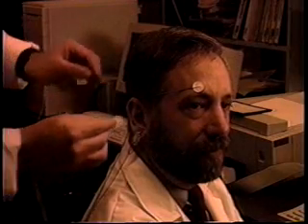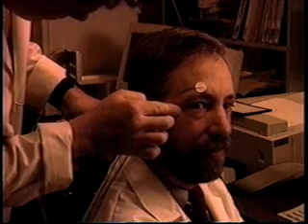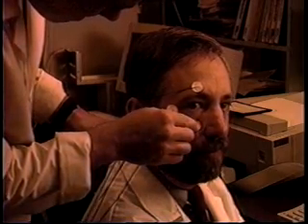We have developed a system that allows the user to control the computer directly through electrodes. Electrodes are placed above and below an eye and to the left and right of the eyes. A clip electrode has been placed on the user's ear.